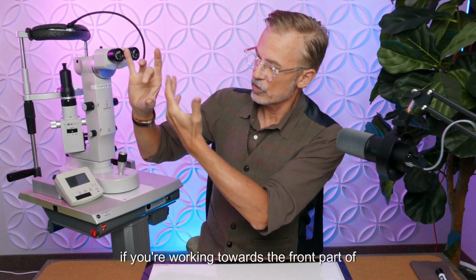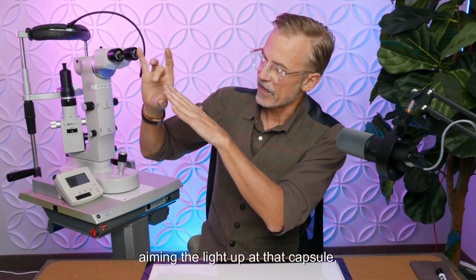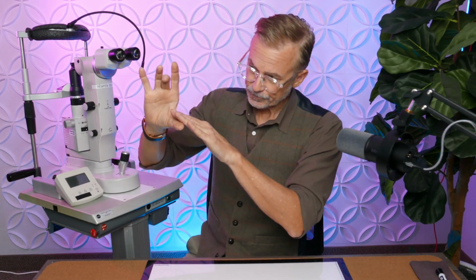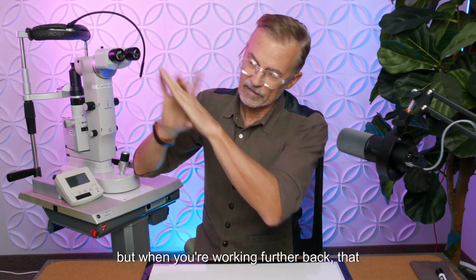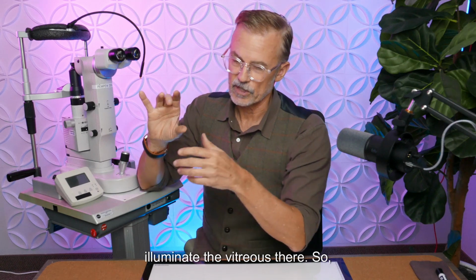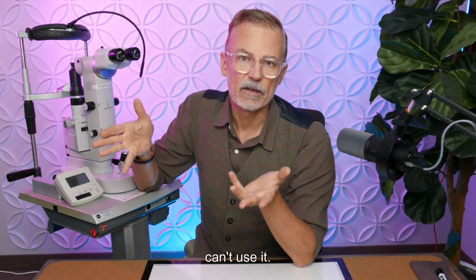Well, if you're working towards the front part of the eye, you can have a low tower aiming the light up at that capsule, and it's out of the way, and you can put that tower wherever you want to, and that's fine. But when you're working further back, that light is just going to go on up and just illuminate maybe the upper part of the retina, and you're not going to be able to illuminate the vitreous there. So if your laser has a low tower, you really just can't use it.